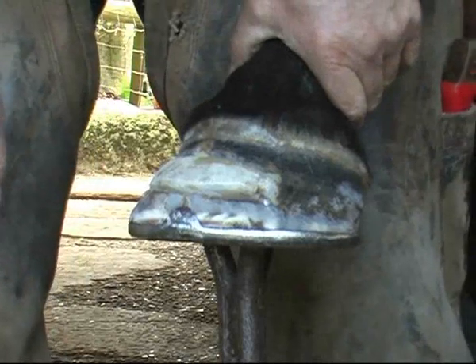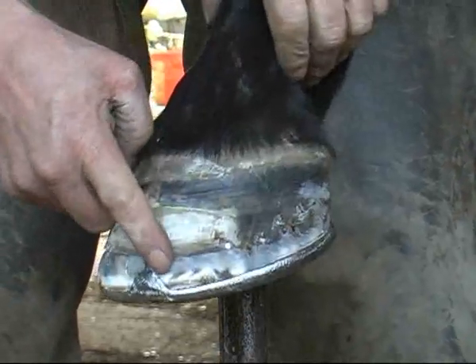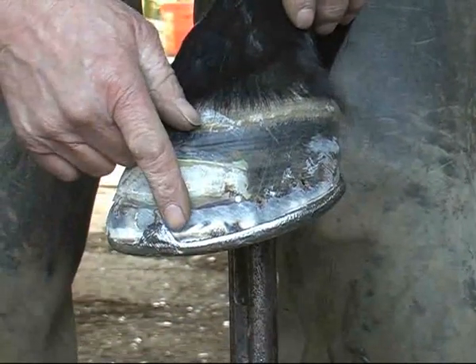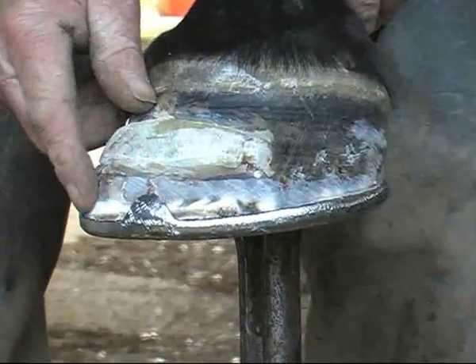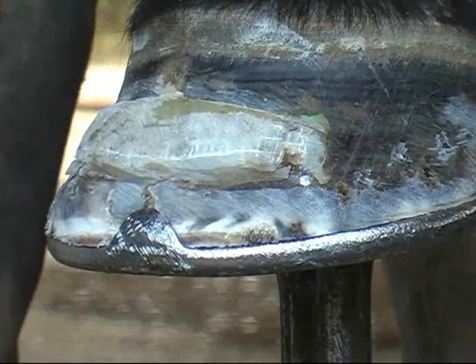What is interesting, if we now look at the migration of the white zone — do you remember the white zone migration on the earlier pictures? The white zone was located here and there was a huge solar plate hanging out underneath it. Now there is no solar plate hanging out underneath it and the white zone has almost got right down to the border of the shoe. I think that's indicative of a greater level of stability in this foot.